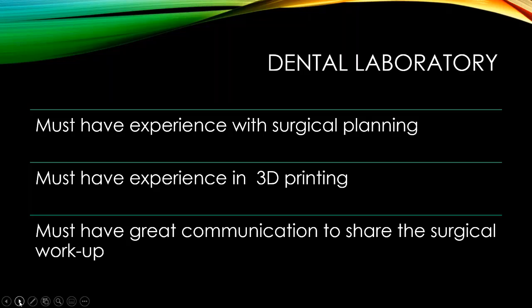For a laboratory to get involved with helping planning, obviously this is another level for a laboratory in complexity. You know, asking them to make a crown for us or to do restorative work is one thing, but now when they cross over and become involved surgically, we want to make sure that they're well trained, that they understand structures, and that they understand how to use the machinery that they have available.